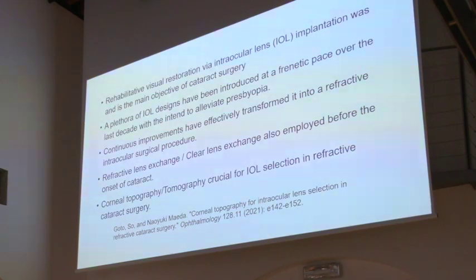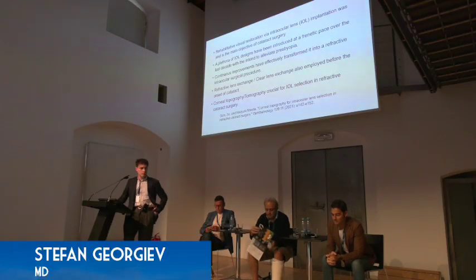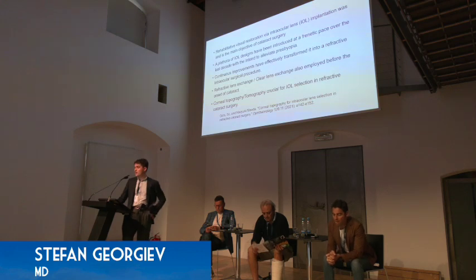And this is also relevant for patients when it comes to refractive lens exchange, clear lens exchange, that are being employed before the onset of cataract. Corneal tomography/topography is crucial for lens selection, obviously, as we previously discussed, particularly when it comes to refractive cataract surgery.